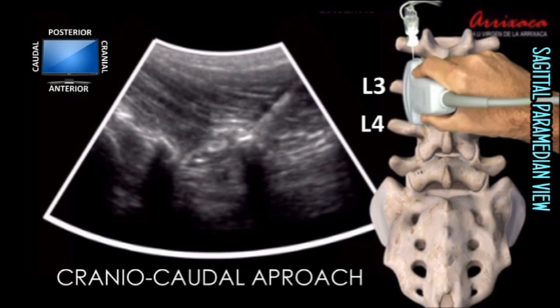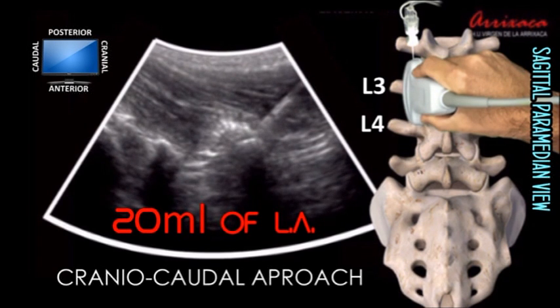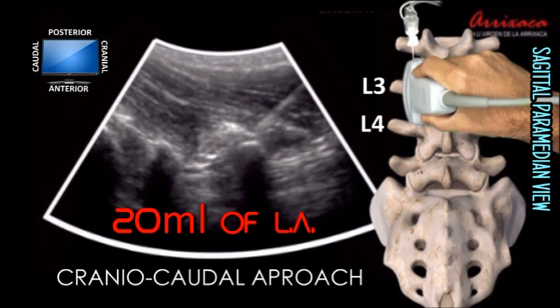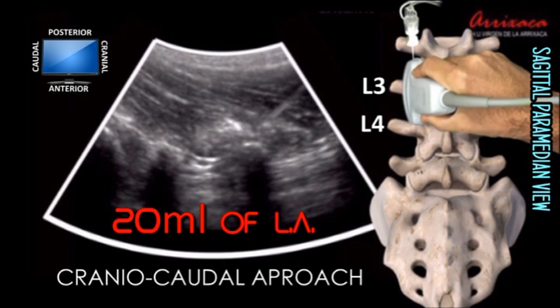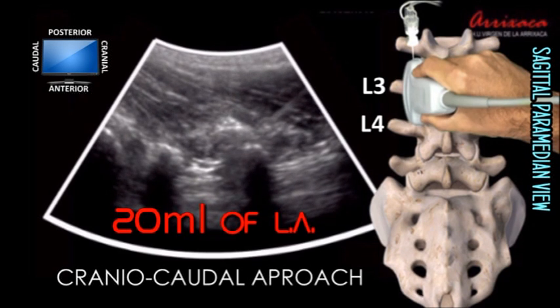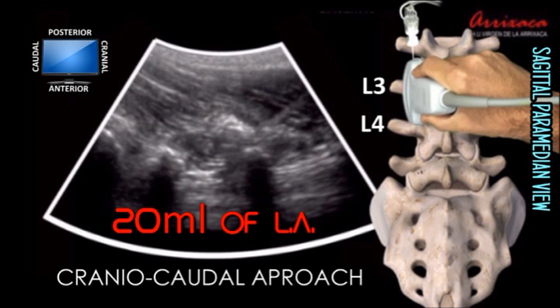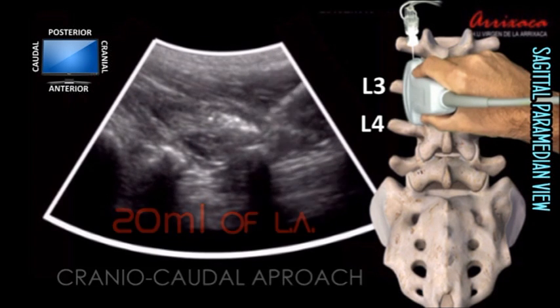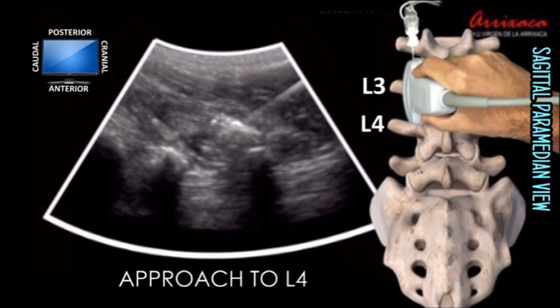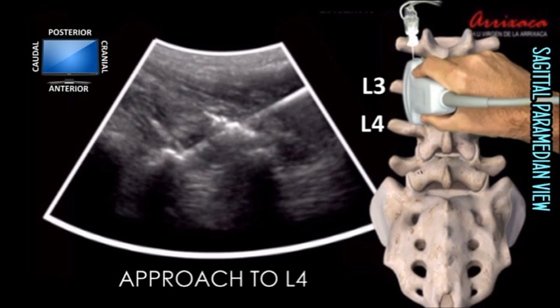The diffusion of the local anesthetic at the lumbar level is not as apparent as at the thoracic level. It is recommended to advance the needle towards the transverse processes and inject part of the local anesthetic at this level to improve caudal diffusion towards the surgical area.